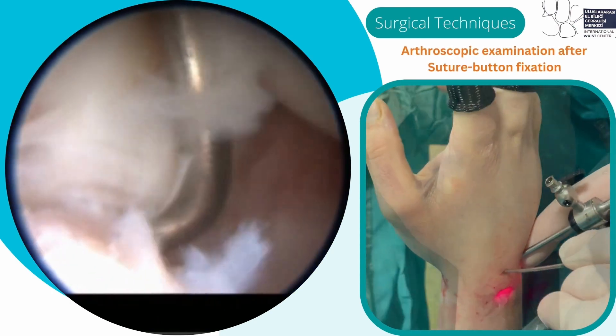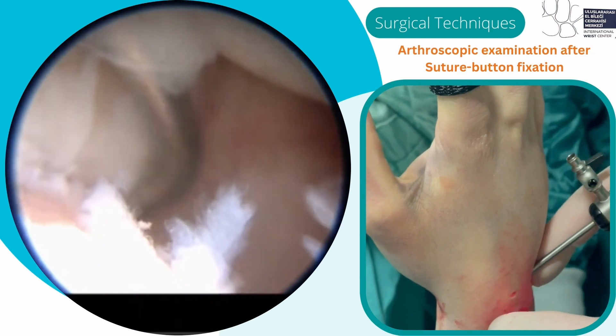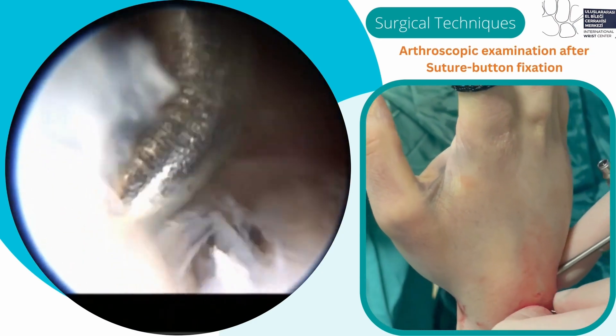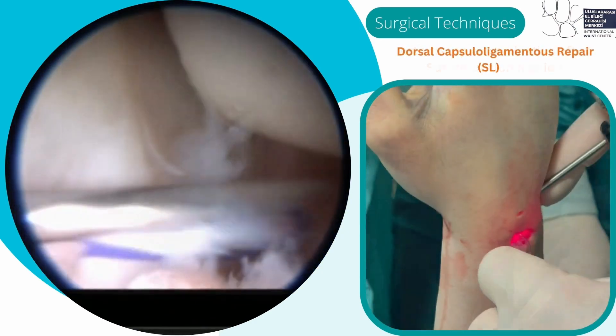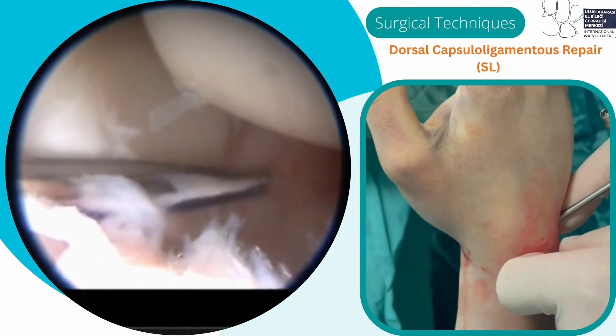The reduction is then checked arthroscopically. Following suture button fixation, no more dissociation or step-off was seen. Then the dorsal capsular ligamentous repair is done for biological healing.